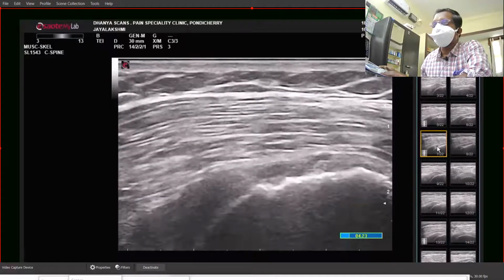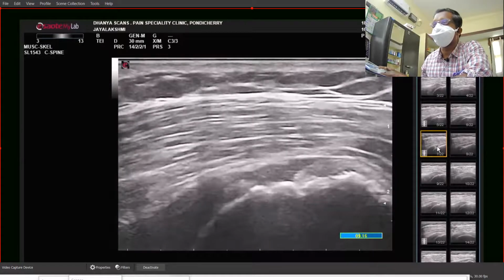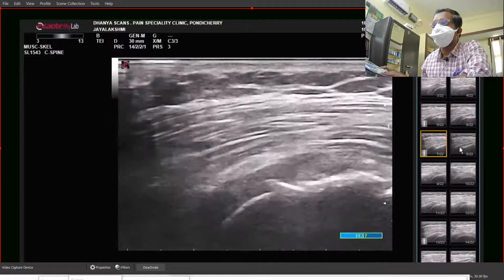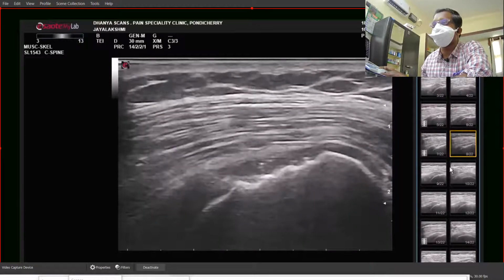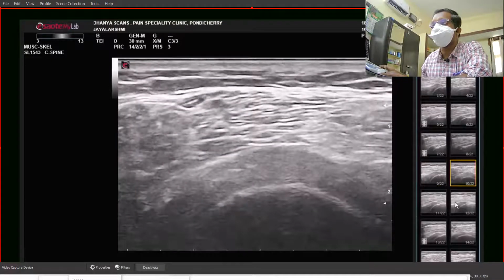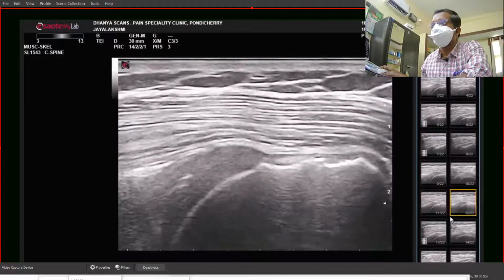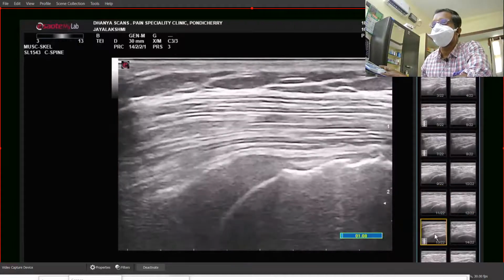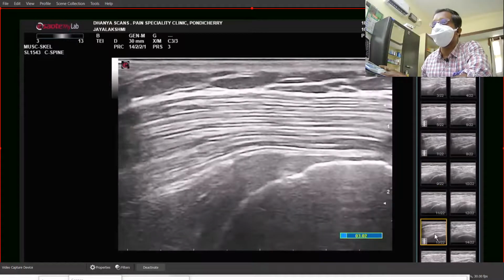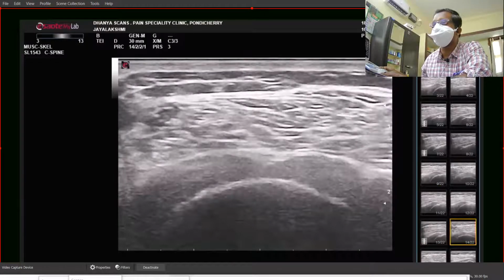Trying to examine the tendon anterior to posterior, appreciate the tendon tear in between, right? Once you appreciate, try to look at the range of movements. Range of movements are pretty normal, except for the pain. So I try to look at the short axis and the long axis view in detail. The moment I saw there was no further pathology, I decided to go for just a bursa injection, avoiding steroid for fear of any further tear. So avoiding steroid was the goal here.